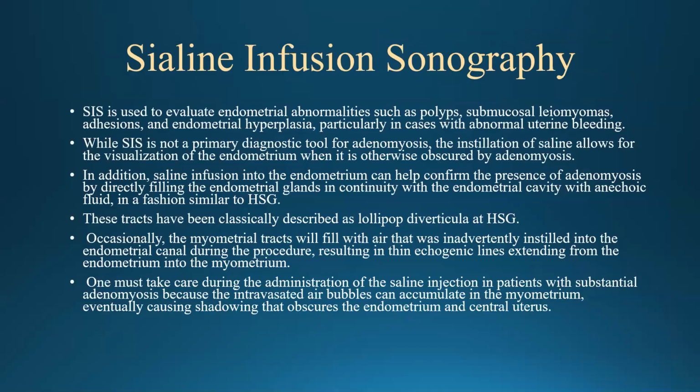If we don't have the facility for a 3D ultrasound, we have saline infusion sonography, and it's used to evaluate endometrial abnormalities. We all use it when we have a polyp or a submucous myoma. Also, we do have hysteroscopy right now, but still sometimes in lower-resource settings we don't have hysteroscopy. So we could use saline infusion sonography.